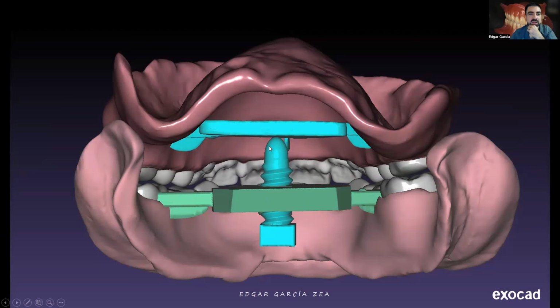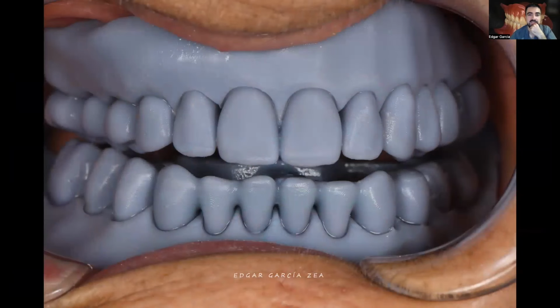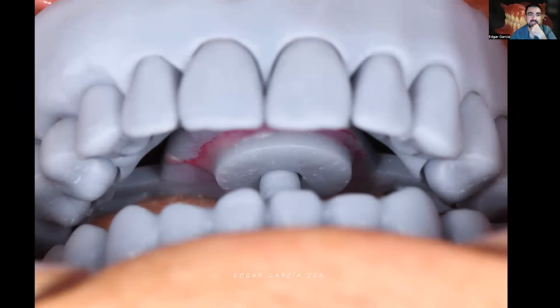Because at this third appointment, I wanted not only to do this kind of closer registration, but also to look at how the patient looked with this size of teeth. So I printed these prototypes. I do the tracing technique also. You have this circle. It's going to attach and prevent the jaw from moving once you have found this position.